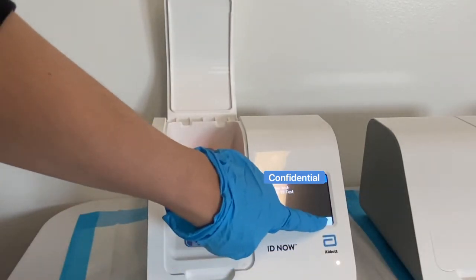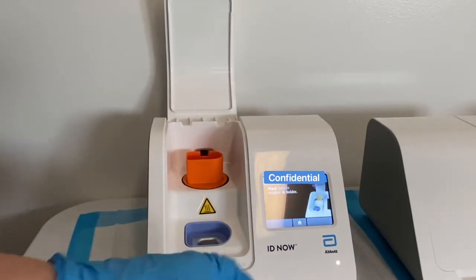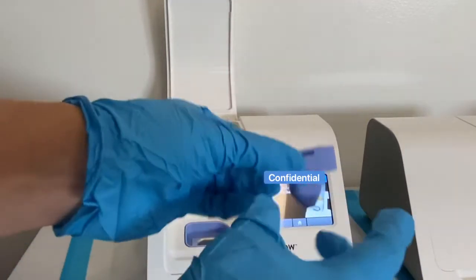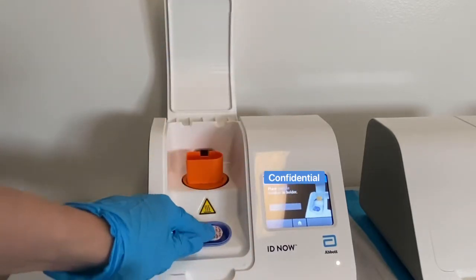Then confirm that this is a COVID-19 test. After that, go ahead and take out packet 2. These two pieces come out, but you want to just use the blue piece for now. This contains the liquid for your sample.